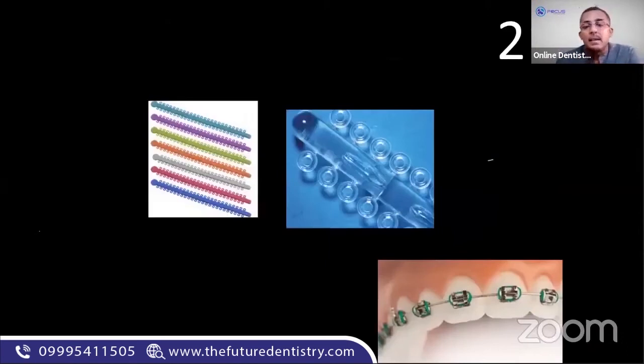Now, this is the elastic module, the color modules you're talking about. Modules come in multiple colors. This was also a question at least 5 years ago. I haven't seen this question coming recently, but you never know. These people putting questions are crazy, guys. They can put anything they want. You should be knowing, yeah? So these are elastic modules.